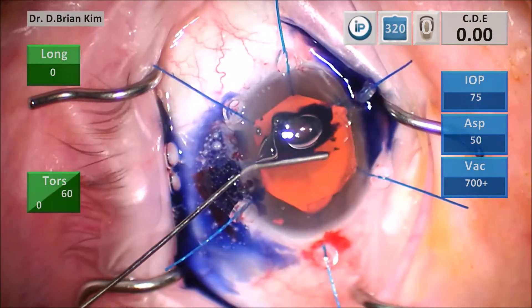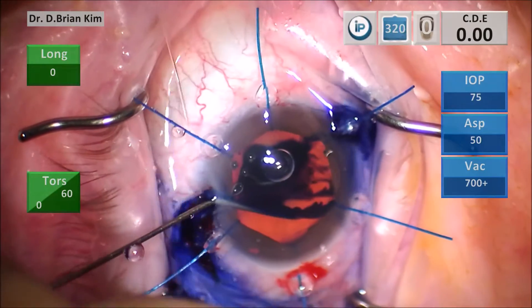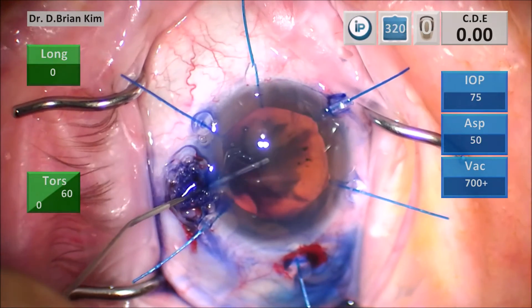I applied TriPan Blue on the surface of the lens just to help with my visualization. This is under OVD, so you need to paint the surface using your cannula.